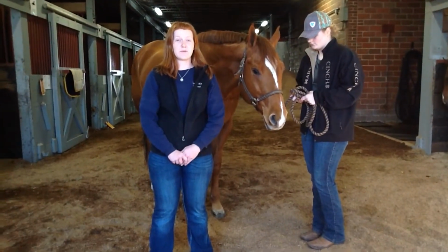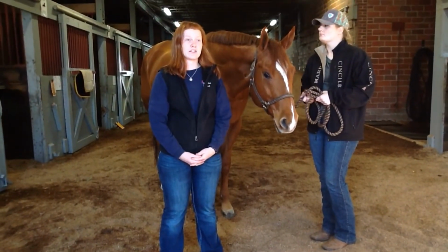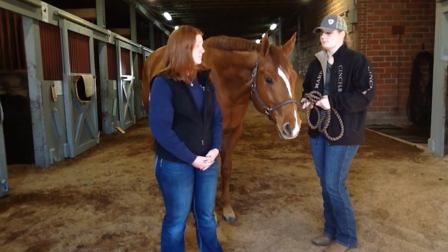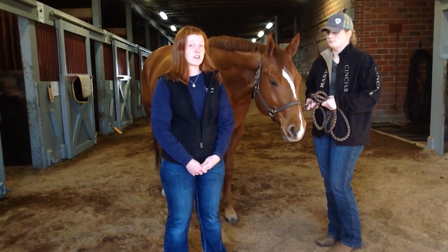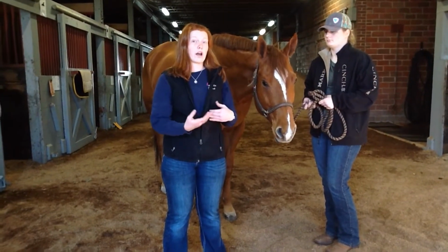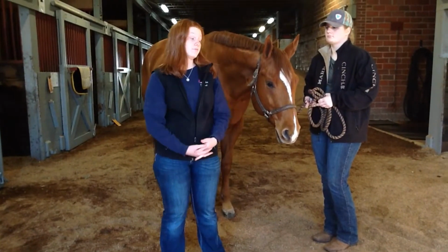Some items that you're going to need whenever you're taking vital signs on your horse are yourself, your horse, and a handler in dire situations, whenever your horse is very unhappy and restless and you need extra assistance keeping your horse in control. For safety purposes, you always want your handler to be on the same side as yourself, but for videoing purposes today, my handler is going to be on either the same side, opposite side, or out of the road of the video in order for me to demonstrate what you need to do.